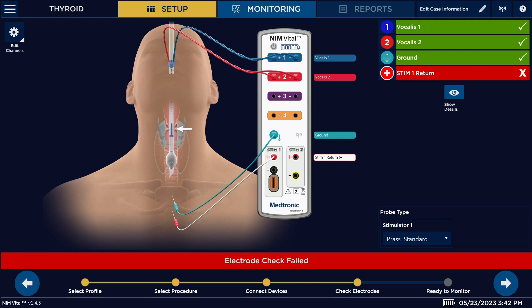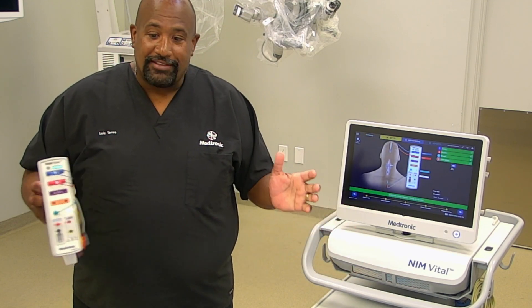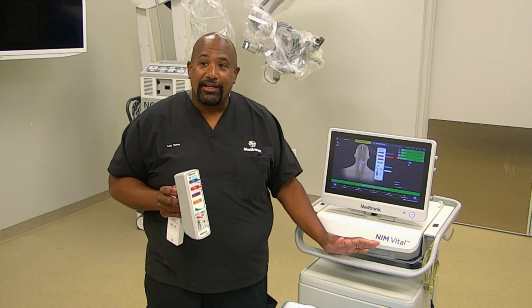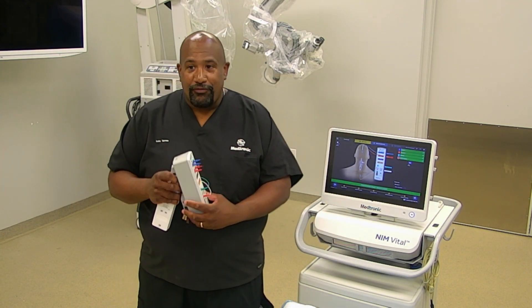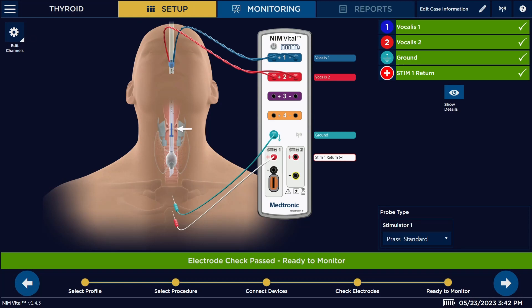Once you get those green check marks on the patient interface, you can go ahead and proceed to the next step. You'll also want to locate your NIM in an area in the OR room where it's not near any other electrical equipment, as you can get interference. Plug it into its own outlet and place it either at the head or at the foot of the bed. Place the patient interface on the bed rail or somewhere where no one is going to be rubbing up against it. Once you're finished with that, just hit this arrow to go next.